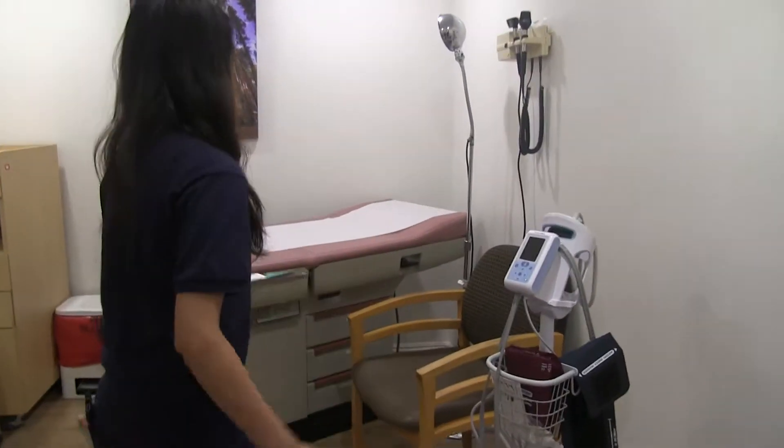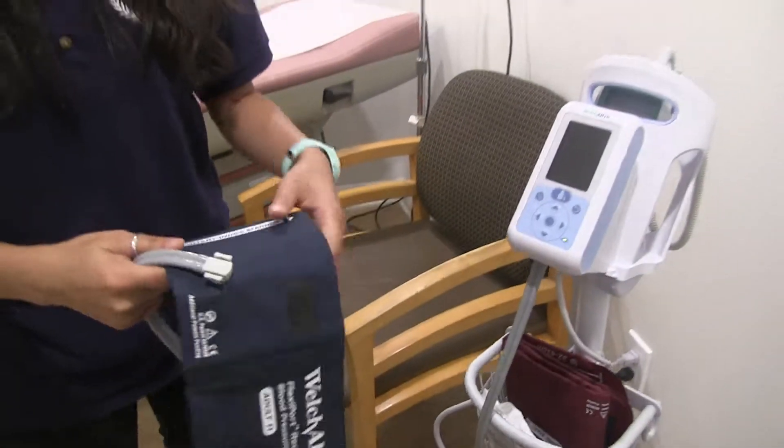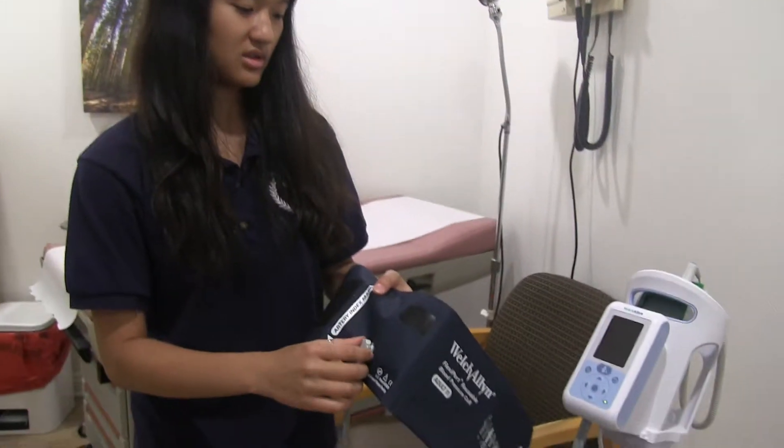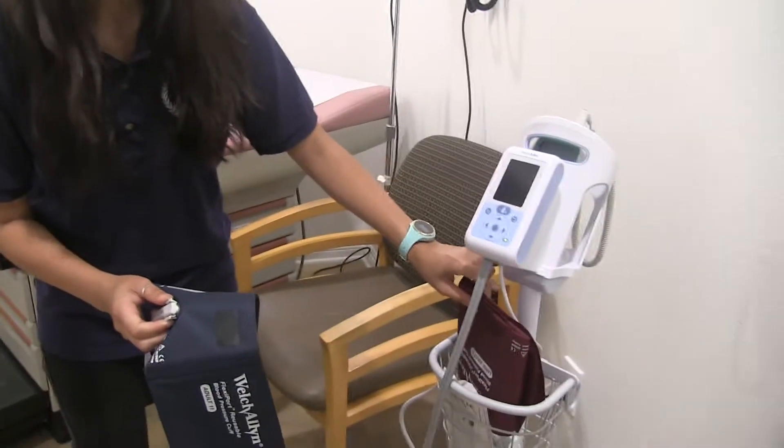Additionally, one more thing — this cuff is fine for most patients, but if you happen to encounter an obese patient or someone with big arms, you can change the cuff to this one, the bigger one.